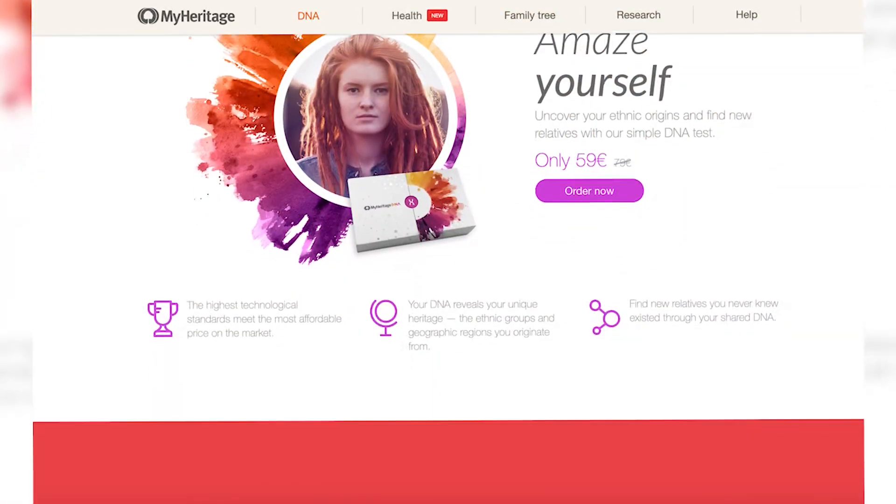Hi guys. In order to research my ancestors, I ordered the DNA kit from MyHeritage DNA, and in total it took three business days to arrive. So I thought I should give an instruction video on how to perform the test. Let's get started.